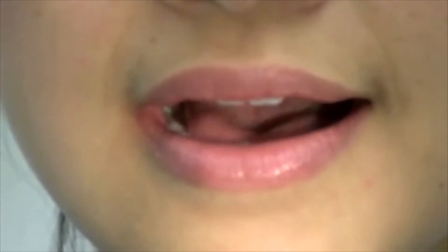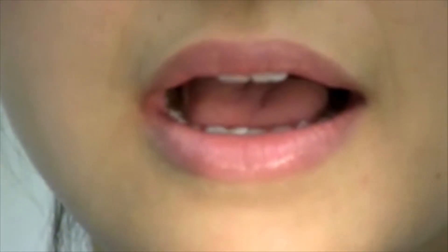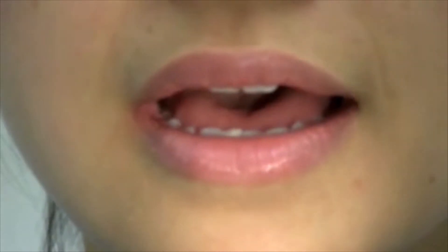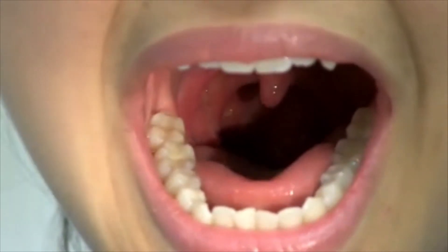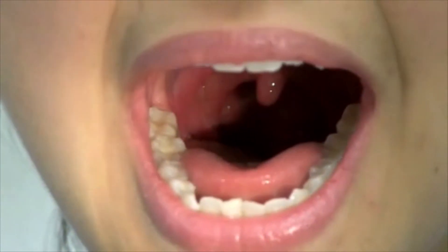Ask the patient to tilt the head back slightly. If needed, ask the patient to protrude out the tongue or use a tongue depressor to better visualize the structures in the posterior oropharynx.